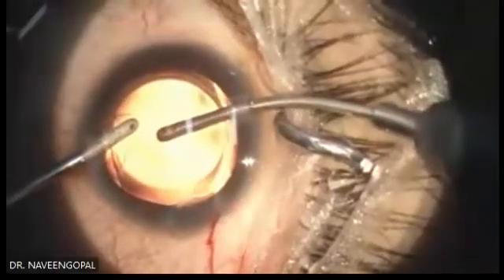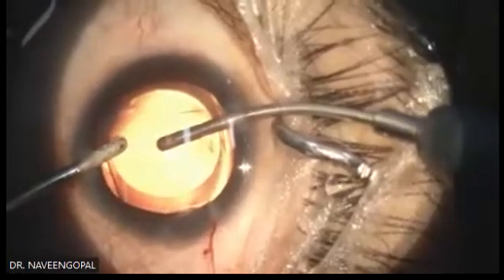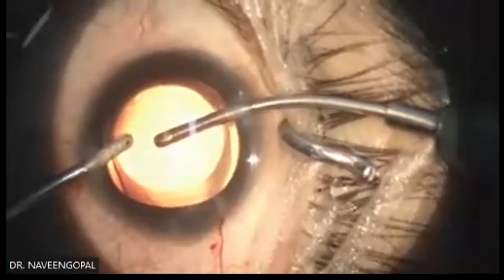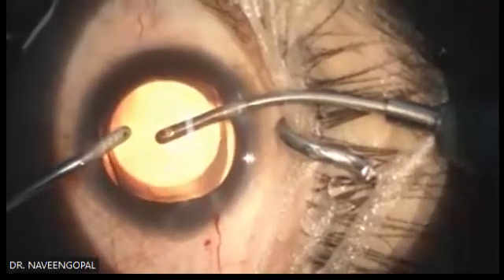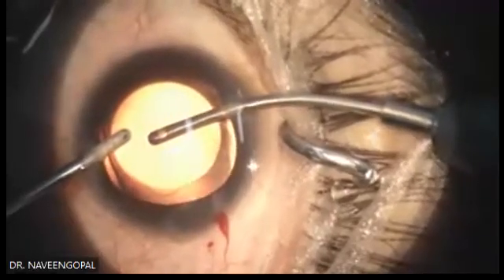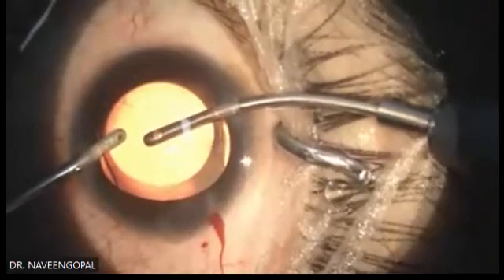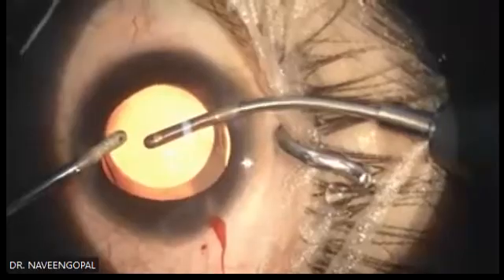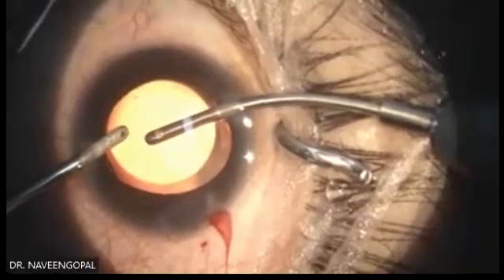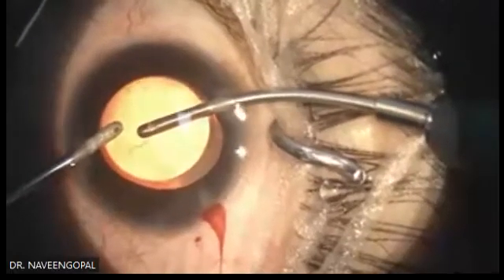First remove the visco which is behind the phakic lens. You just keep your irrigation at the hole. Can you see the hydro-like thing which is coming? Drainage of the visco and the saline. Saline is going through the central hole, going behind the lens and taking out the visco which is behind the lens, which is the first thing I do. Or else, if you do this in the second attempt, the AC will collapse. I don't want that to happen. That's why I do this first.